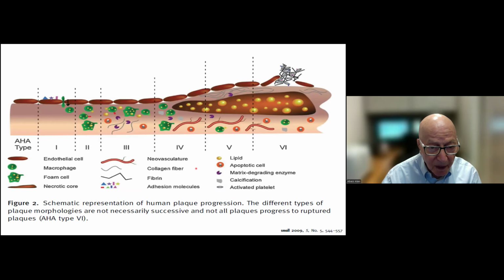Patients who have plaques have a lot of macrophages and foam cells that are inflammatory in nature, and we can detect it with FDG, but also we can detect calcification in the earlier stages of the disease. And that seems to be a very promising area of research with PET imaging.